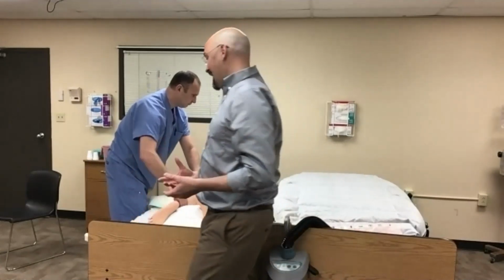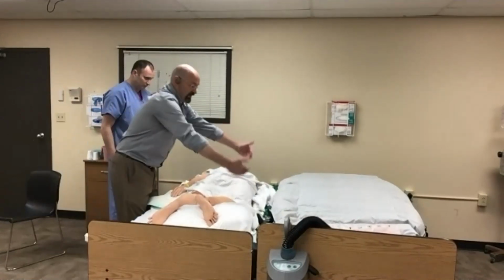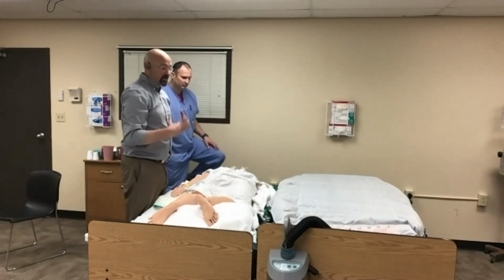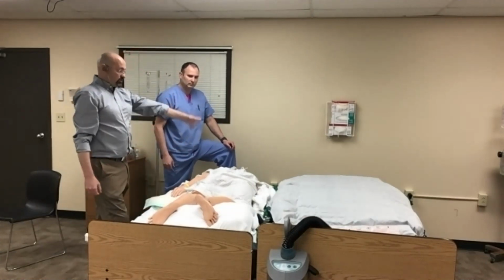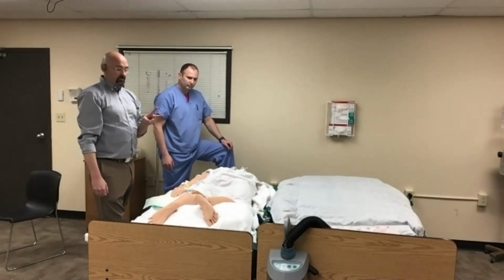So again, what we're going to do now is show you what that looks like with somebody who's actually on it. The patient's weight, when you get to the edge of this surface, will automatically, by pushing down on the mat, prone them directly into the space. The larger your patient, the faster and easier they're going to turn. So my rule of thumb has always been one person to do the airway, and then at minimum, always 2 people to do the transfer. At 200 pounds, 2 people.